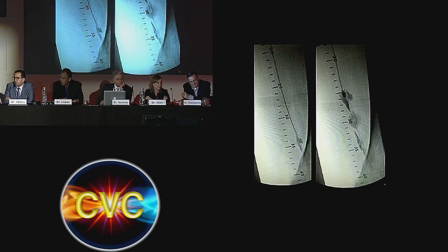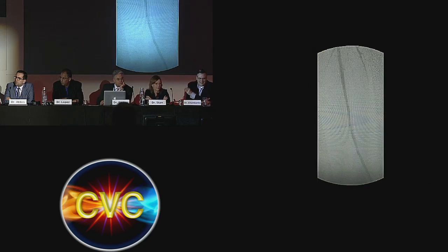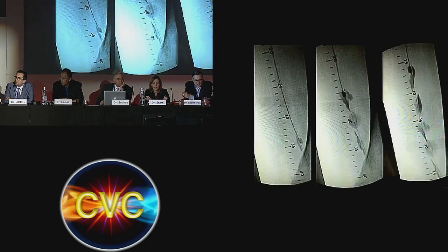So click next, next, next. And you can see those 4 spots. There's one more, I think, Chris. Nope, then go back, sorry about that. 3, there you go. So you can see those 1, 2, 3, 4, 5 spots where there was an ejection. That does not relate to extravasation, or at least in our experience hasn't been related.